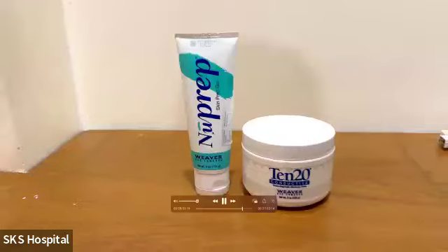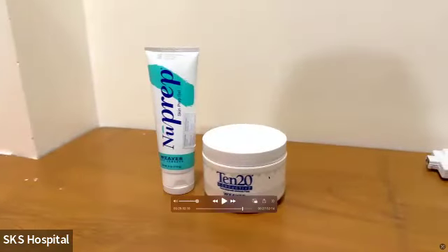So these are the two things which we already told: the 10-20 gel is the conductive paste, and the NuPrep gel is the skin prep gel to prepare the outer layer of skin so that any dead cells or anything can be scraped off. First, NuPrep gel will be used. Once it is wiped off, 10-20 gel will be used for fixing the leads along with the micropore.